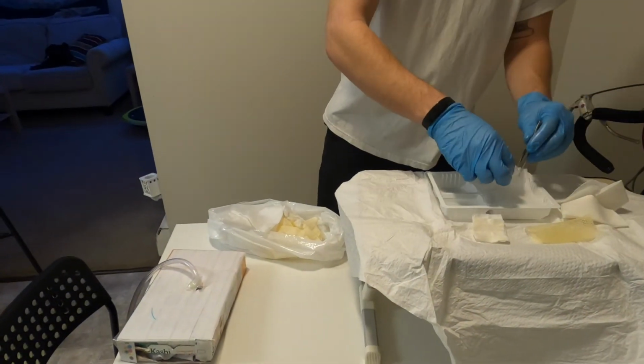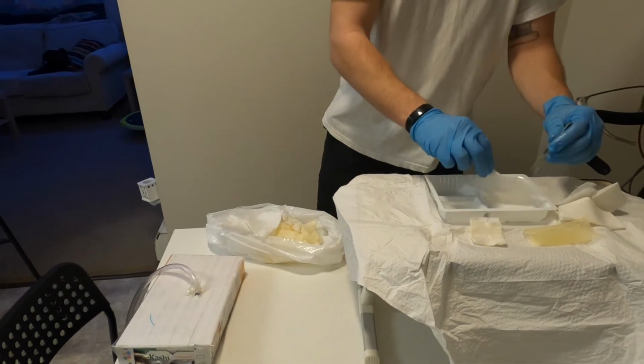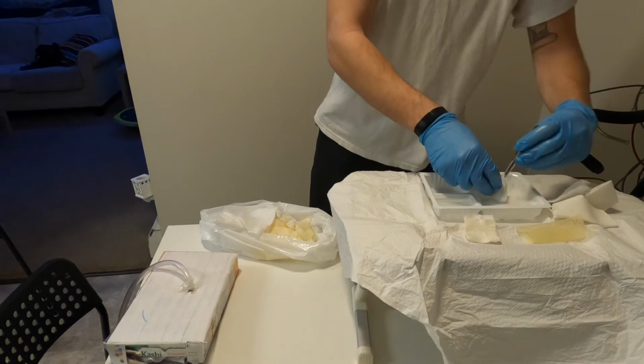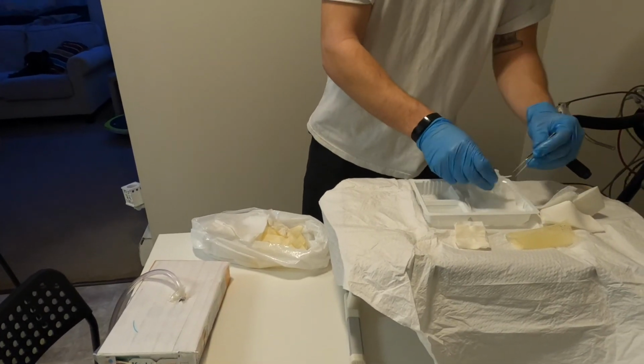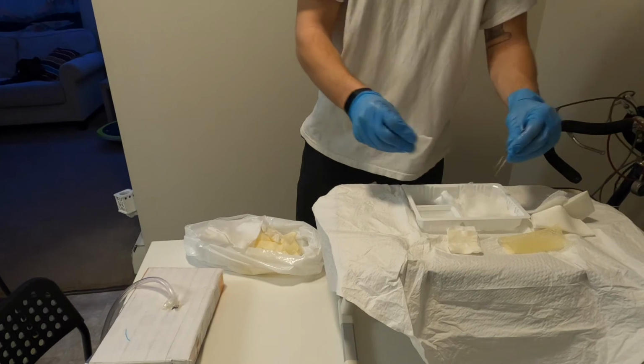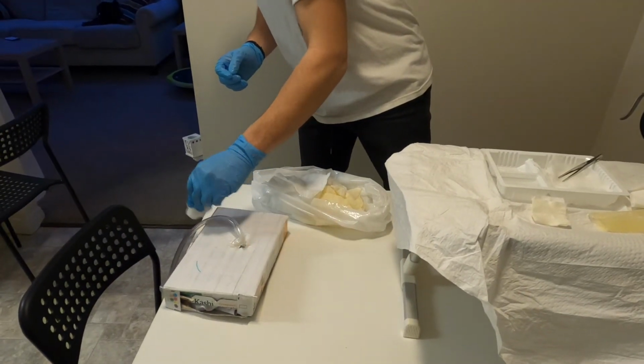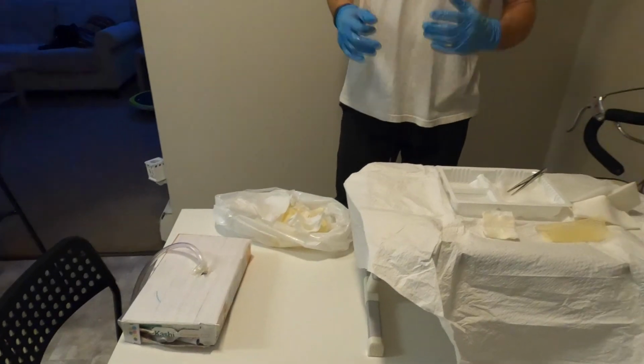And last one just on top. Then I'm going to assess the peri wound. Good, I can just go like this actually. Perfect.